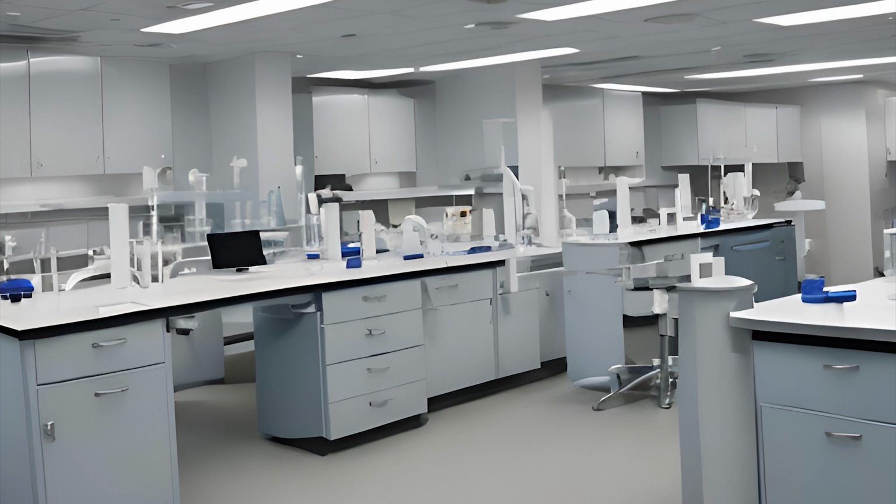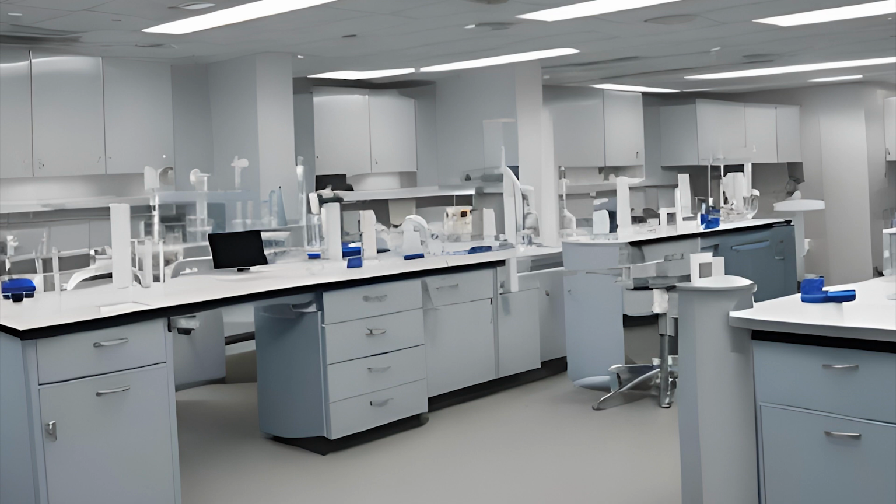I am going to note, however, that I have seen cases where a tube that was allowed to have the fluid sit on the thixotropic gel for several days had carryover of analytes, contamination of analytes from the formed elements diffusing through the gel into the fluid above the gel. Specifically, there were cases where that occurred with potassium that were investigated. So do keep in mind that thixotropic gel is not a perfect separation.